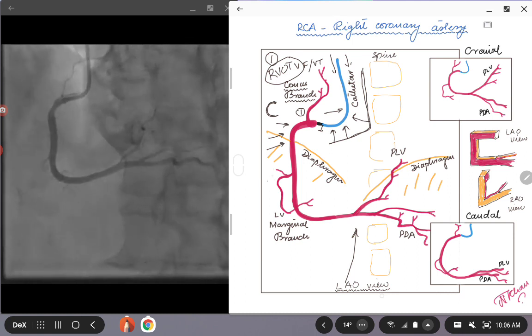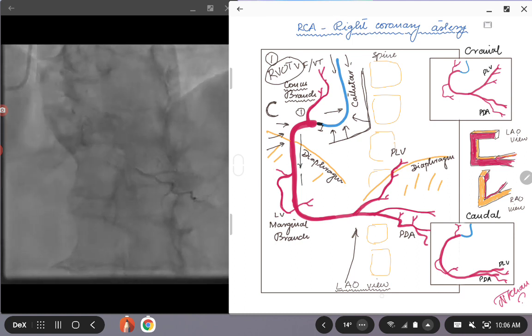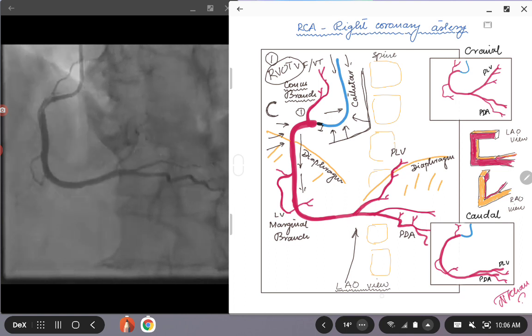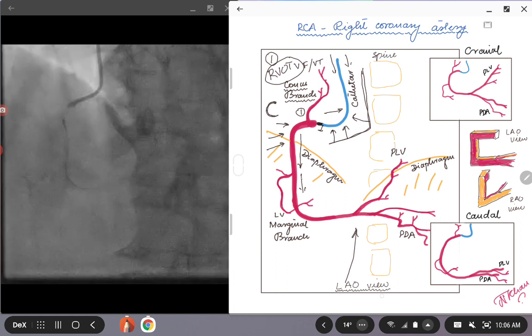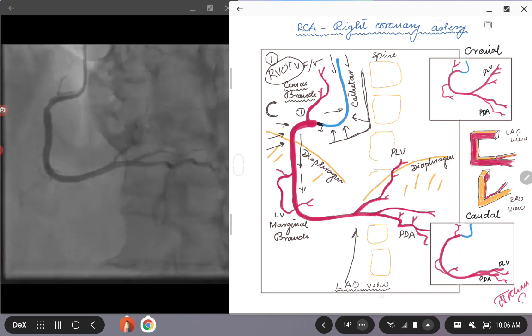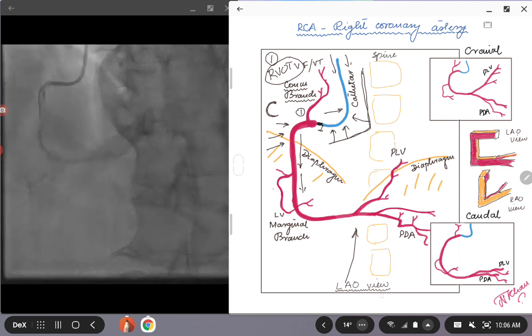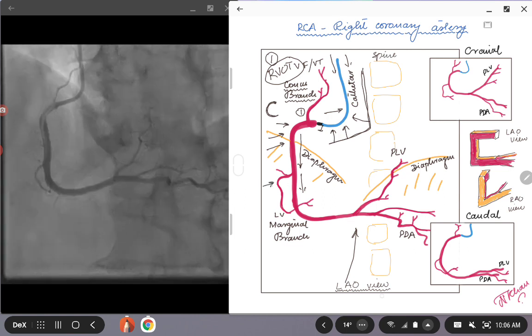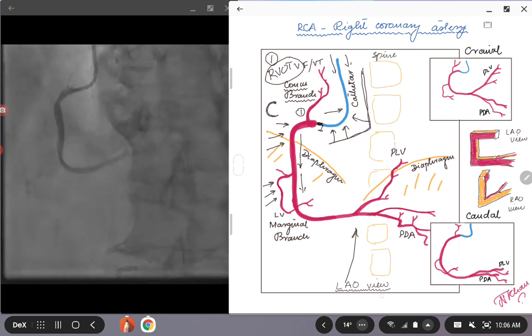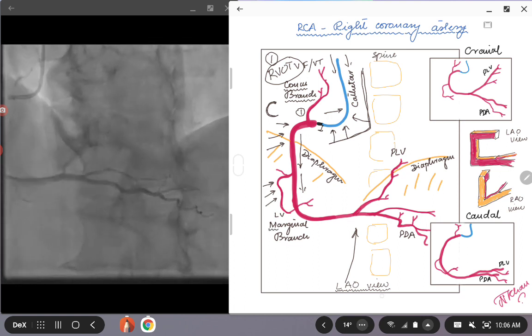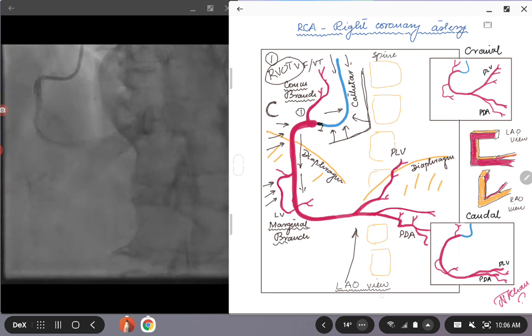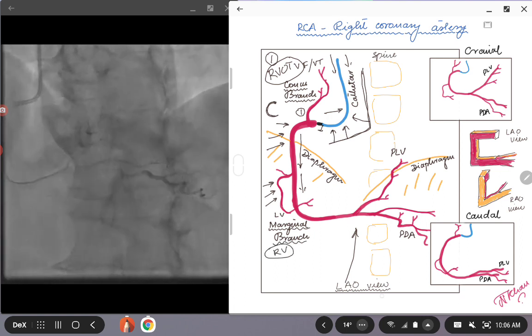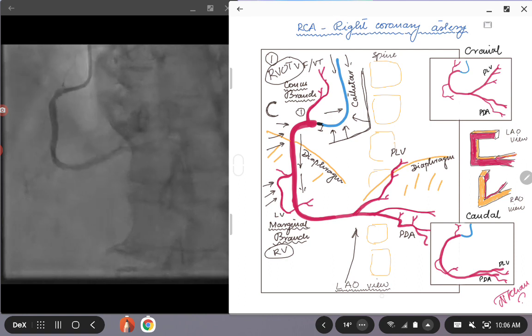Then we move down. This is the body of the right coronary artery. You can see it nicely, and as I said, in LAO view you will see the right coronary artery open up nicely like a C. In the middle of the artery you will see a branch, it can be one or two branches, and these are called the marginal branches or we also call them RV marginal branches.